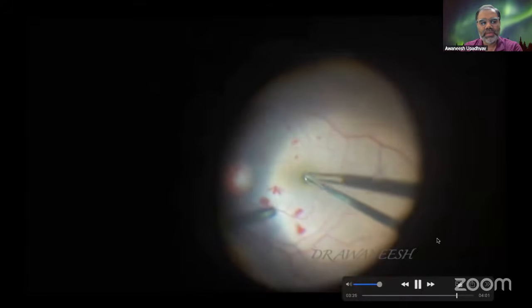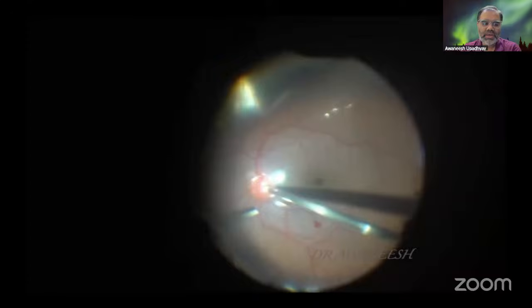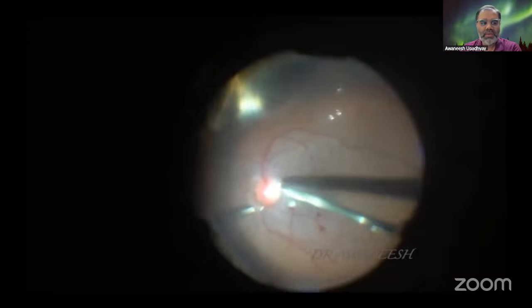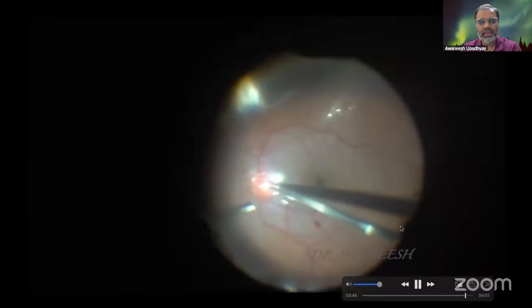In your case, you can see we are using a folded ILM forceps, and that is being used to stabilize as well as close the hole. And then again, you can see the cutter which has been used. Once that fluid-air exchange is complete, you can slowly see the graft is not getting dislodged, and I use a tamponade, and then I use positioning in these patients. Thank you, Dr. Bhatt.